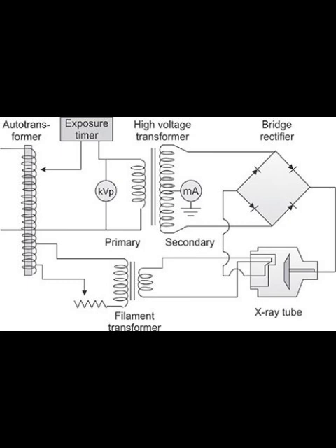Okay, that makes sense. Now let's shift focus a bit. We've got the current type sorted, we've got the voltage levels managed, but what about the quality or the characteristics of that electrical output itself? Yes, the waveform details. Because these things directly impact the final X-ray image, right? You're talking about things like phase, pulse, voltage ripple, frequency. These sound like quality control factors for the electricity itself. Yeah, absolutely are, and they matter a lot.